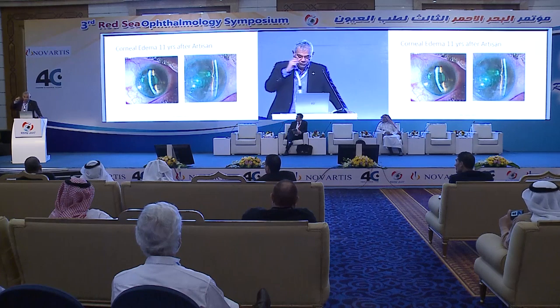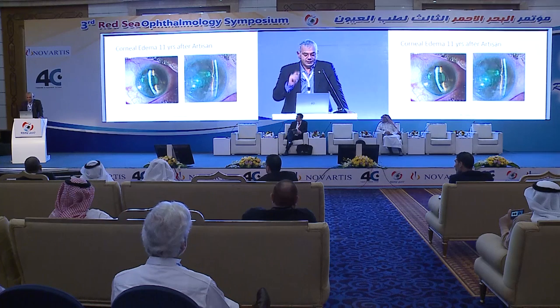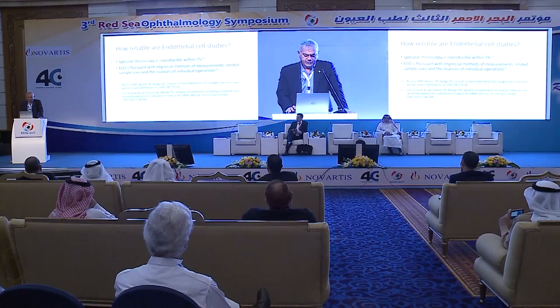And this, if you want to take one message from this presentation, is that you should not put an Artisan lens in a patient with anterior chamber depth that is less than 3 millimeter from the endothelium. I've done DSAEK on many of these patients.